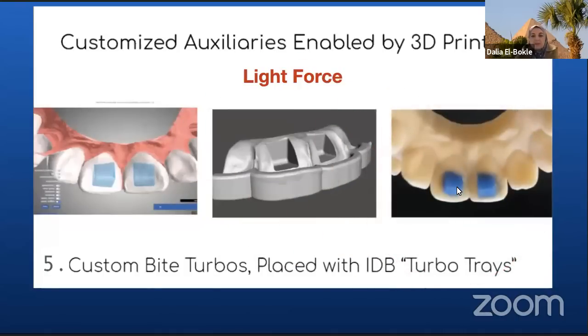And there is a really nice advantage of using those digitally designed 3D printed bite turbos. They have been proposed by Lightforce, and the advantage is that no adjustment will be required, which is really nice to have as an advantage to reduce aerosols inside the clinic these days with the COVID-19 pandemic.